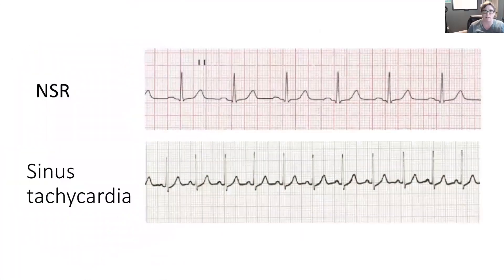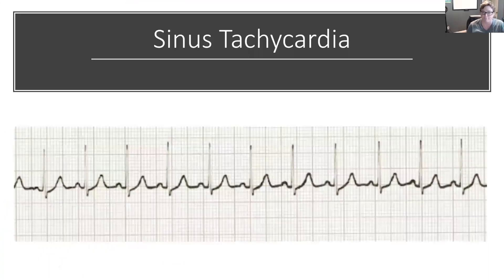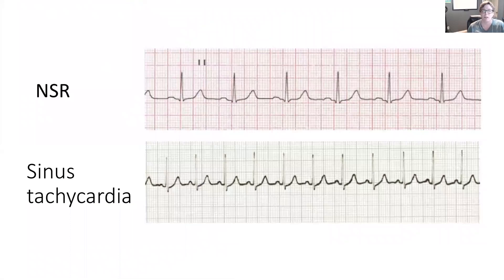It really becomes important to identify the underlying cause in order to select the right treatment. Here is a sinus tachycardia ECG: you can see the characteristic P wave, QRS, and T wave, but they come very quickly. The ST segment is not flat because the rhythm is happening so fast it moves right into the T wave. This is pretty common in sinus tachycardia — the ST segment will not be on the isoelectric line, almost like a slurring of the J point into the T wave.